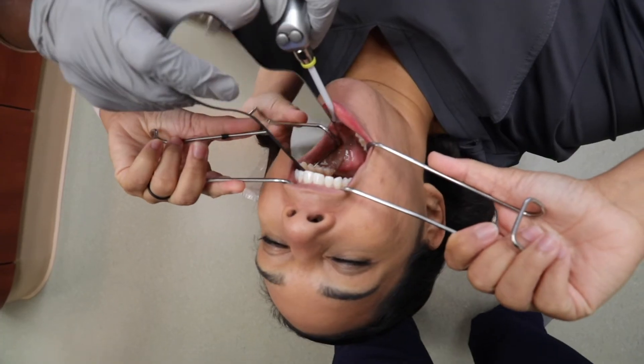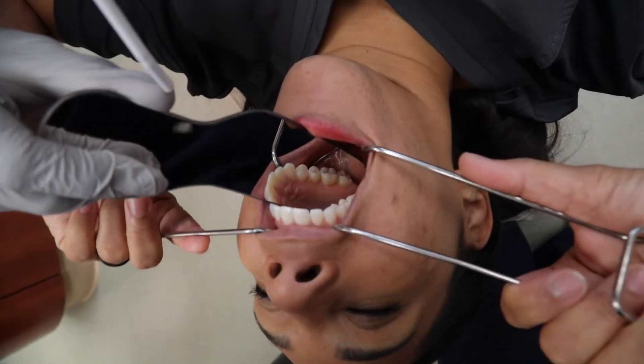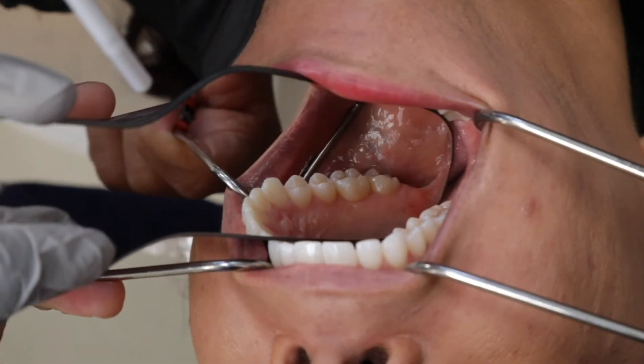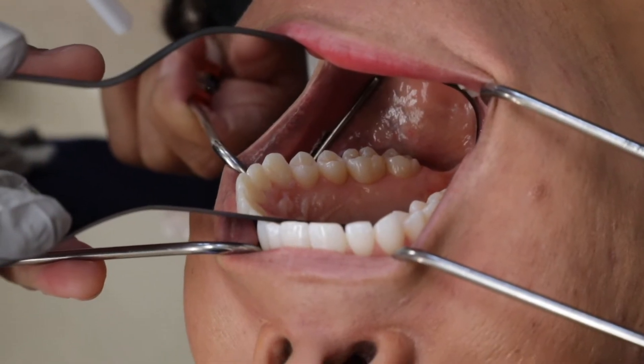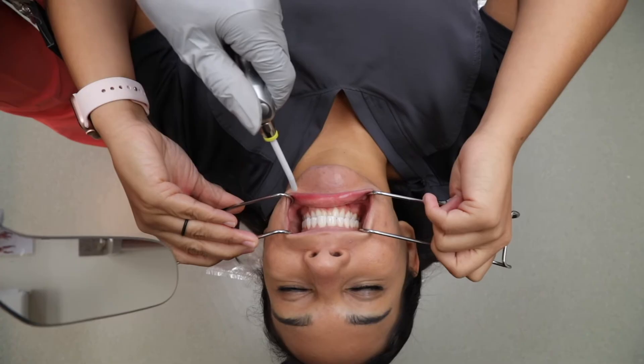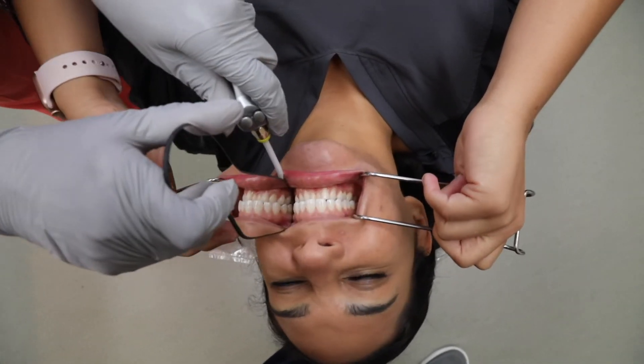I always have the assistant operate the mirrors and an air water syringe. The air water syringe is used to blow saliva off the teeth to keep the teeth and tissues as dry as possible. It also helps defog the mirrors. In addition, I will encourage my patients to suck in their spit and swallow to clear out as much as possible. In some cases I will also have my assistant use a saliva ejector to clear saliva before taking photos.